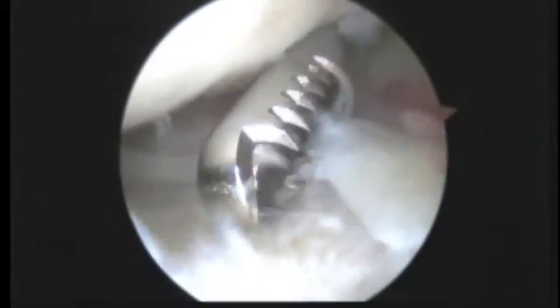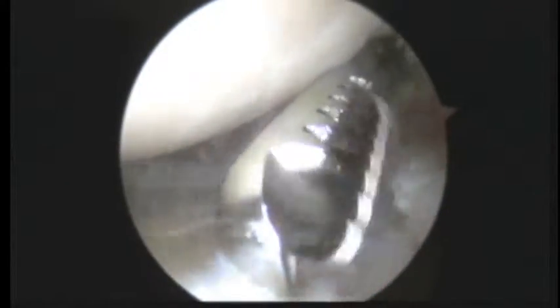Hi, Mr. Jones. Dr. Buford. We're just getting started on the left shoulder. We're looking at it from the back to the front. We've got a fair amount of arthritis on the inside here, inside the joint, and we're using this instrument called a shaver just to smooth out some of these rough areas as best we can.